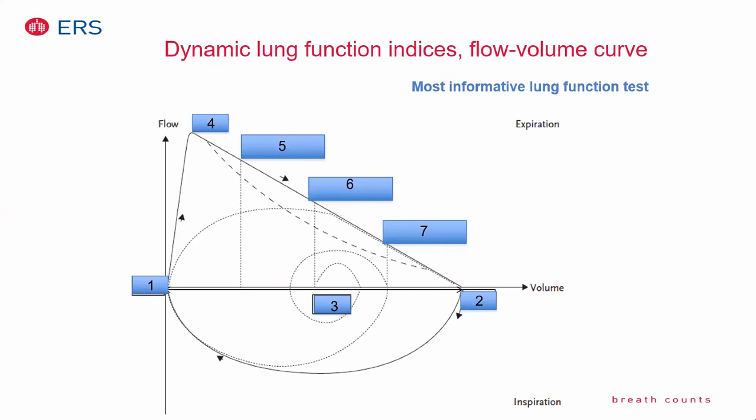The other curve that you obtain from the spirometry is the flow volume curve. So this is the one curve you will see the most often when you do lung functions. And you have here these forced flows. Here the inspiration and the expiration. So you start like before at the total lung capacity, and you breathe down to the residual volume. The volume that you've expired here is the forced vital capacity. And here on this axis, you will see the flows.